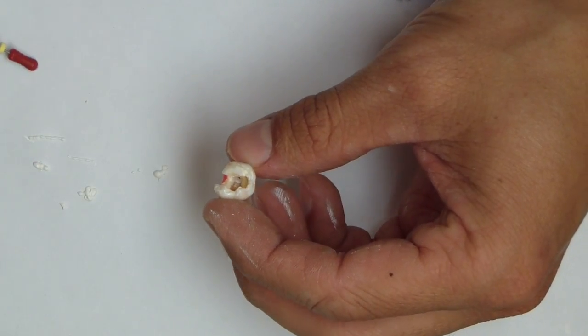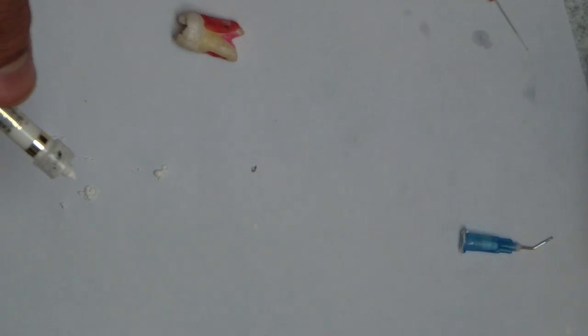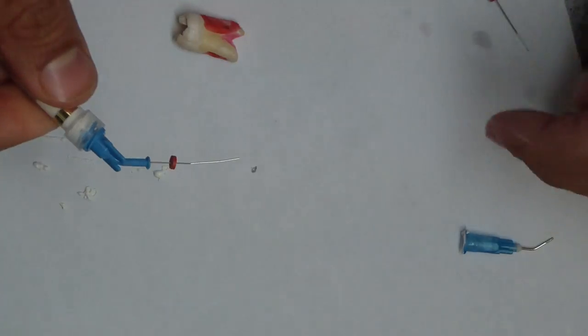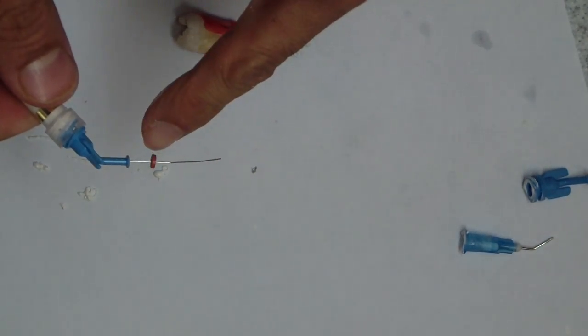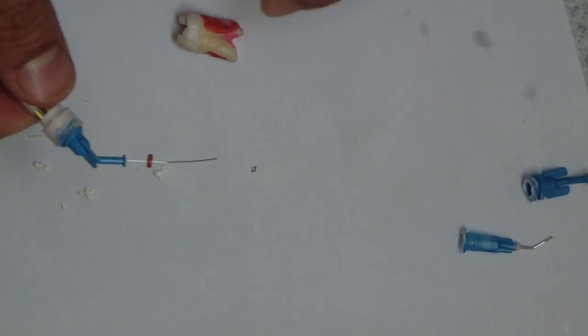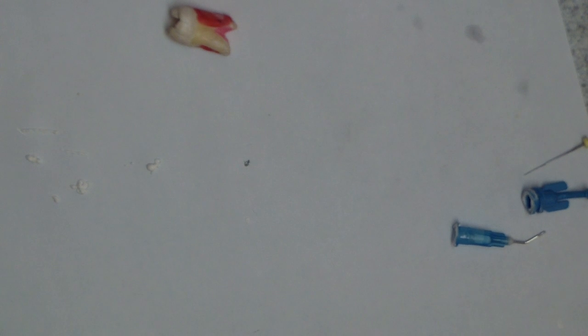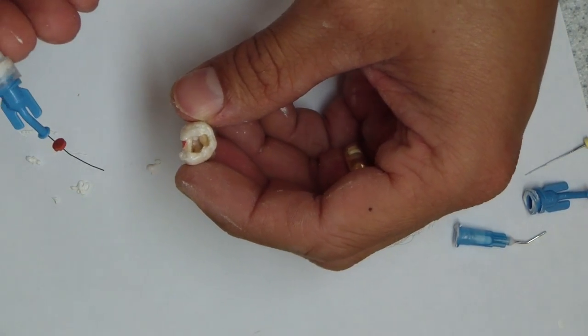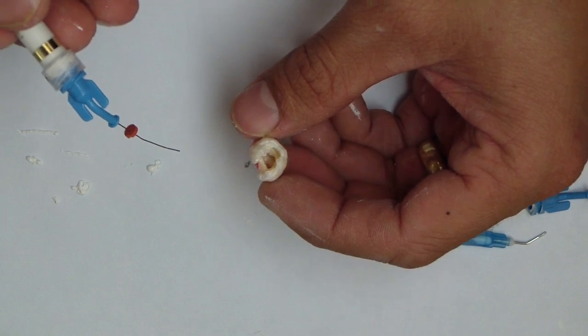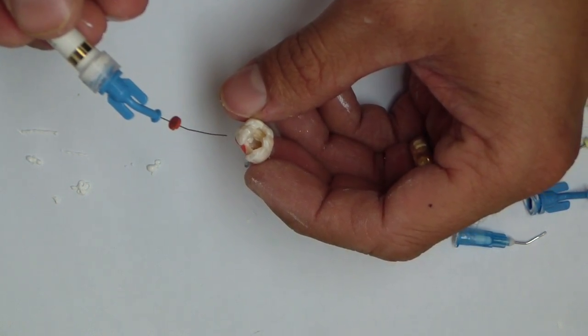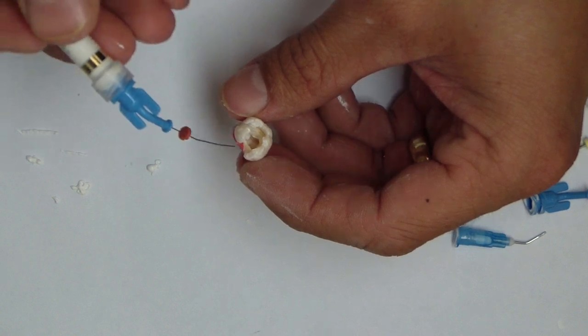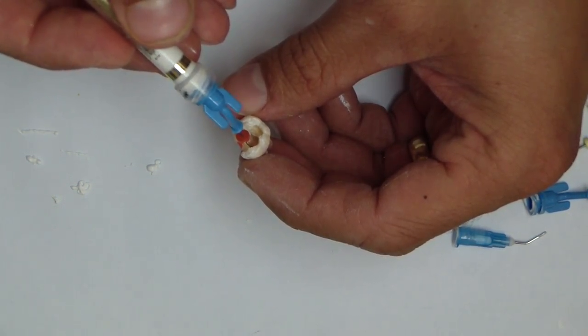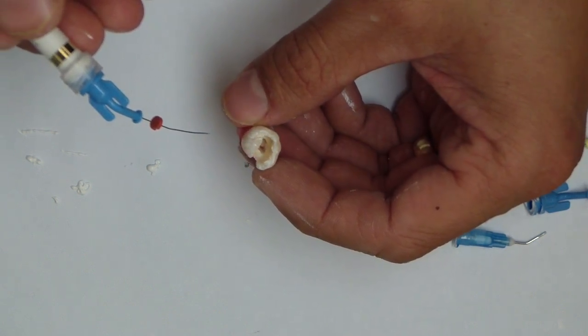Another way I've been introduced to is using NaviTips—by no means am I advertising for one company, but this is what we have. This is a stainless steel tip, 25 millimeters long, comes in different sizes. This is a 29 gauge, which equals .26 millimeters, just less than a 30 file. I'm not using the microscope because probably 80% of folks watching don't have one. Calcium hydroxide placement is much easier with a microscope, but let's do it with loops.